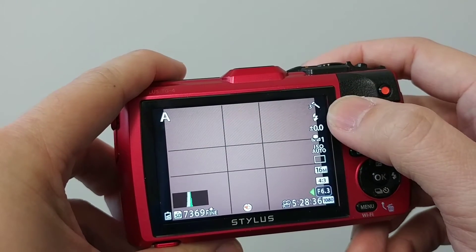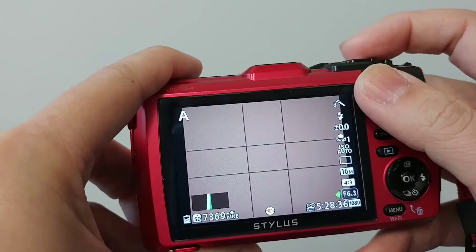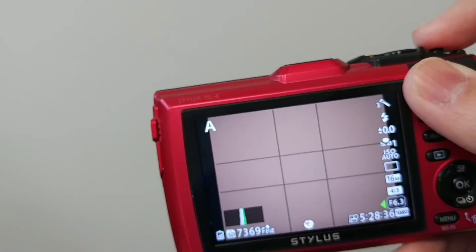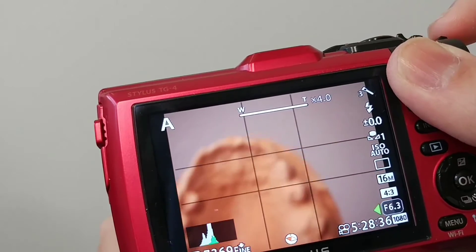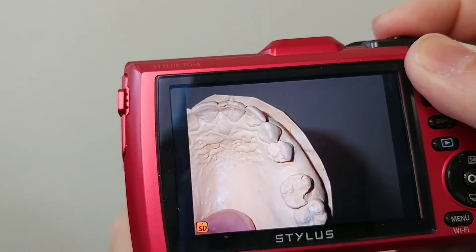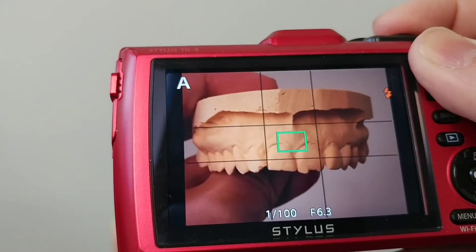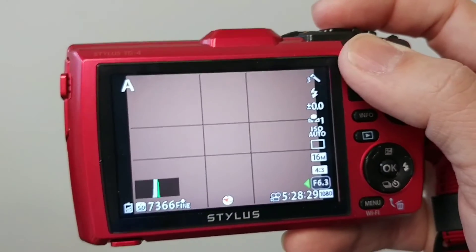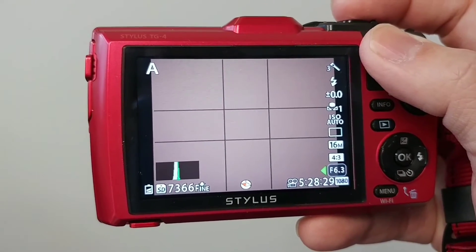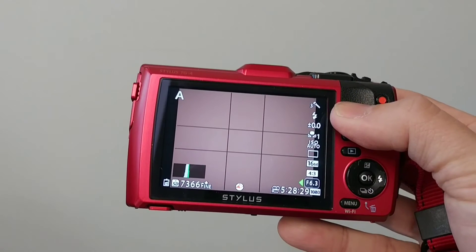My muted color, flash always on, custom gray balance, and f/6.3 are all permanently saved. I just tell staff to zoom all the way forward, aim, and shoot — and you get some pretty nice photos. I've noticed some lip shading on some quadrant shots; you can angulate it slightly. That's a limitation of having a single-point flash, but for $380 new and $300 refurbished it's a pretty good deal.